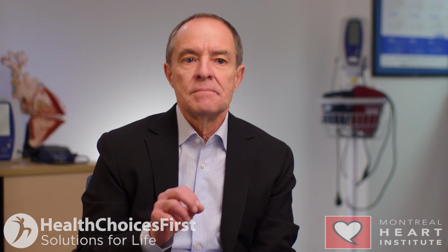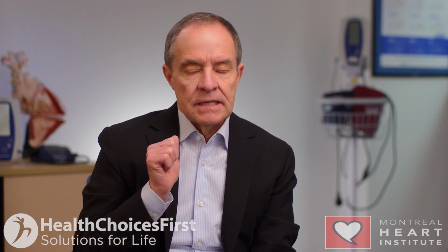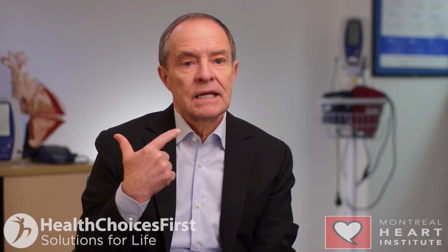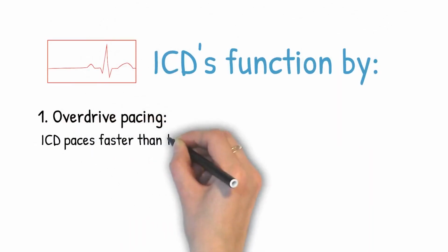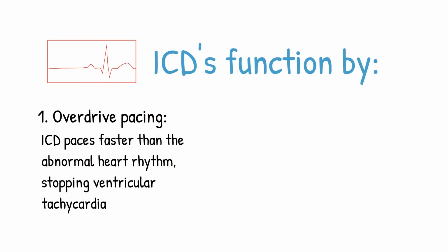So the device and the lead continuously monitor the heartbeat of the patient. If the device detects an abnormal, serious, and dangerous heartbeat, it will identify it and correct it. It will correct it either by what we call overdrive pacing, to pace faster than the abnormal rhythm, which is painless.